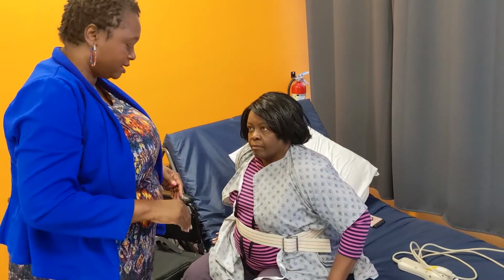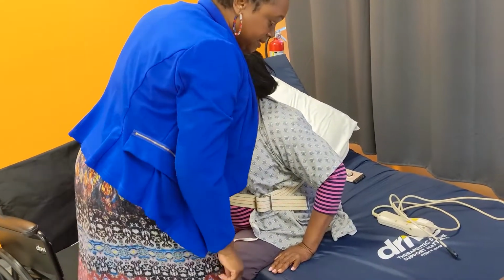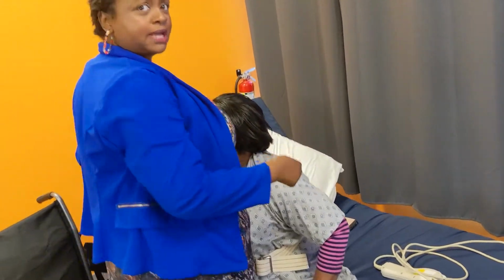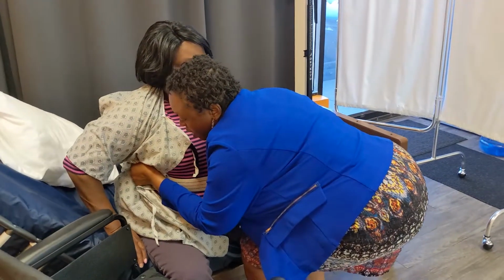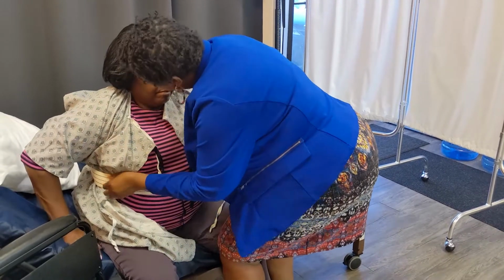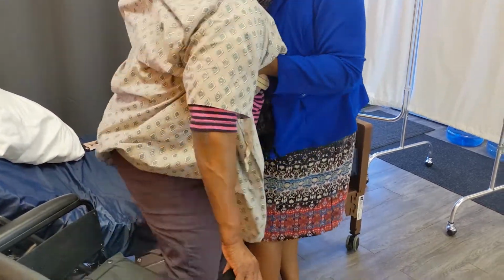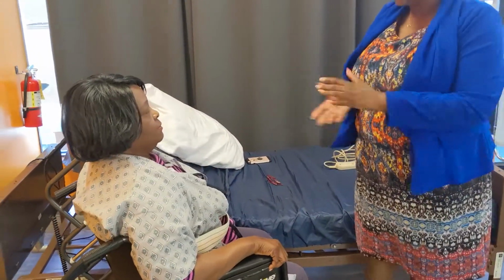All right, and so we're gonna count to 3. So I'm gonna come close. Again, I have my knee, the patient's knee, and my other knee sandwiching. I'm squatting down, and I think maybe if you sit on this side to see, okay. So I'm squatting down, I'm squatting on the count of 3. And then when you stand up, you take this arm, reach for this arm rest. You good? 1, 2, 3. Stand up, reach. Okay, so that's a pivot technique.